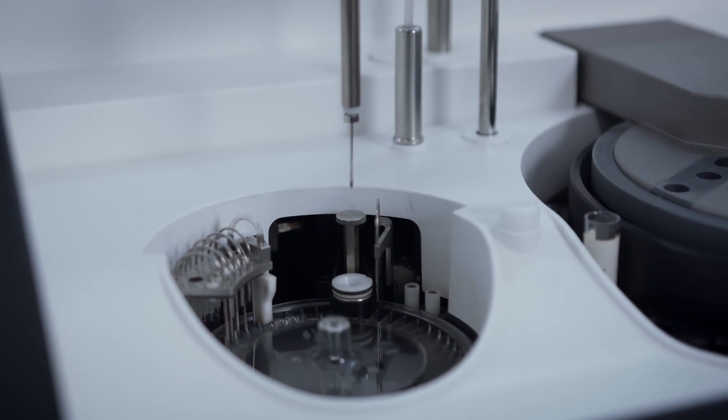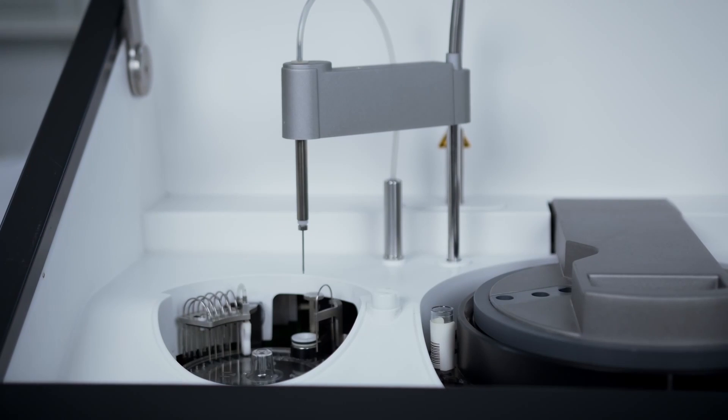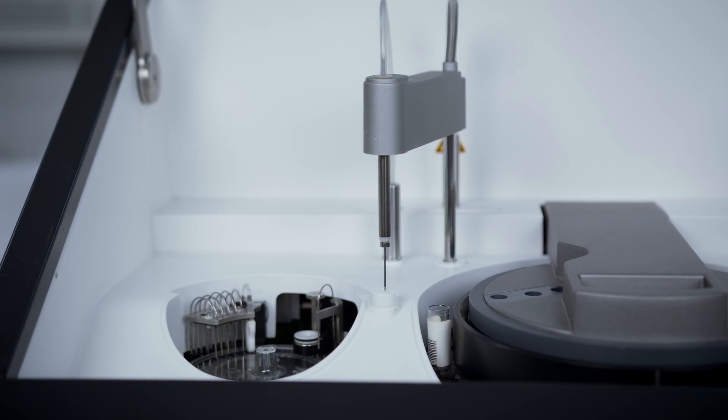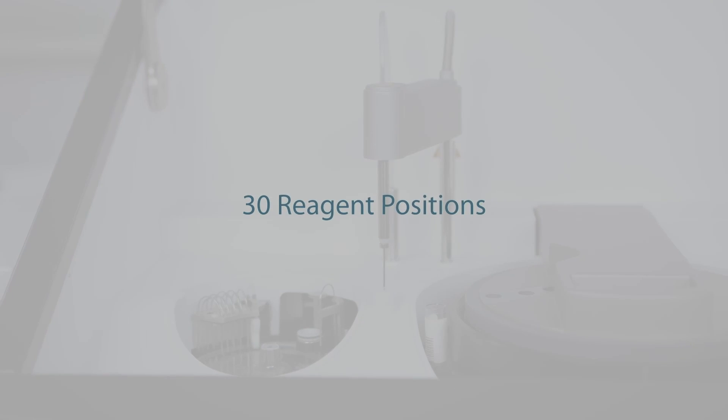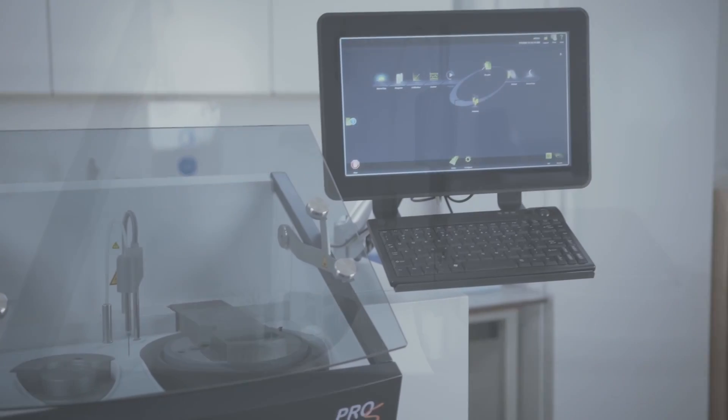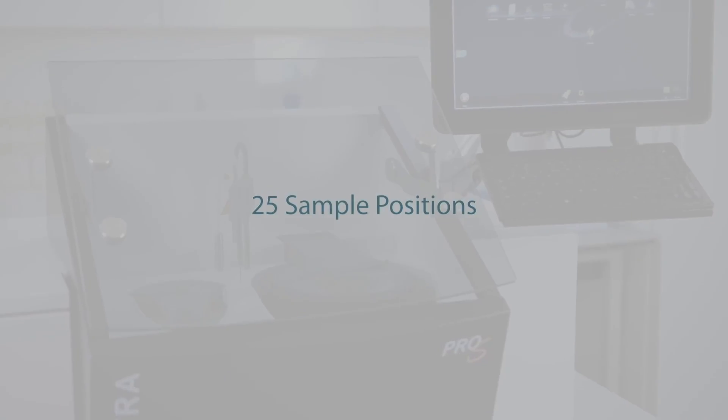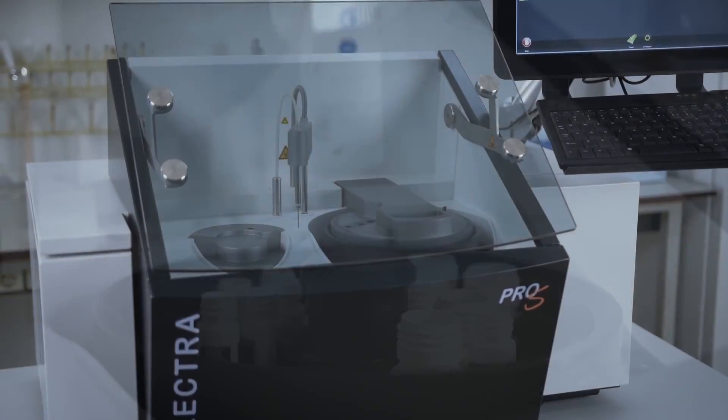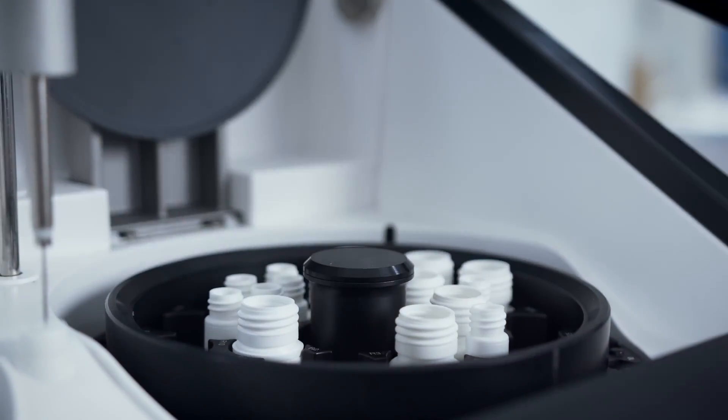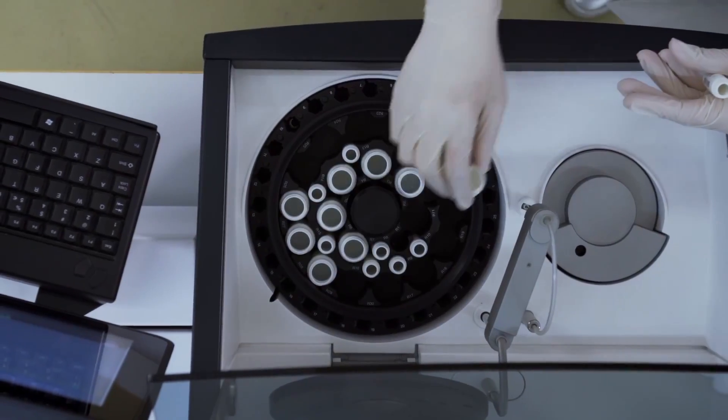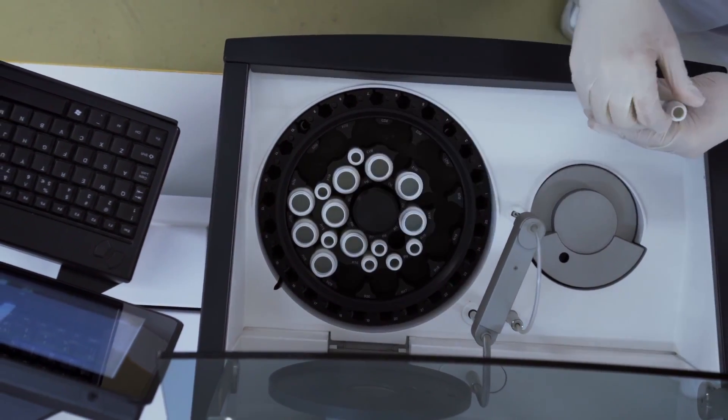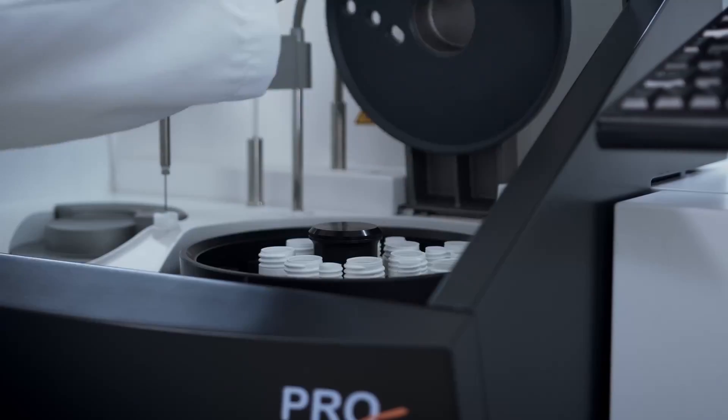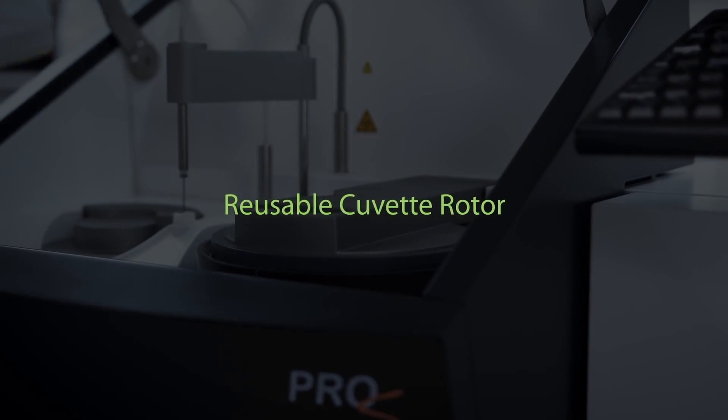The reagent and sample handling are conveniently combined within one module. The inner rotor ring features 30 refrigerated reagent positions, and the outer rotor ring facilitates 25 barcode readable positions for primary and secondary tubes. All positions can also be used for calibrators, controls, normal, pediatric, and STAT samples.